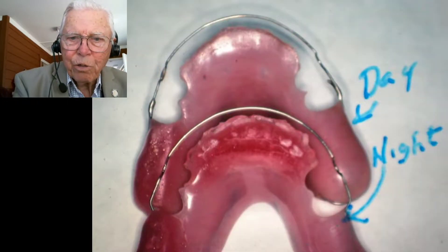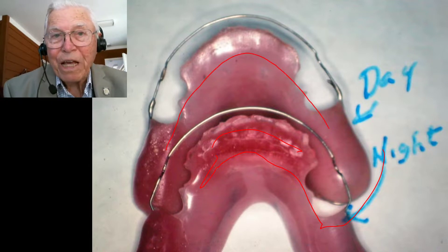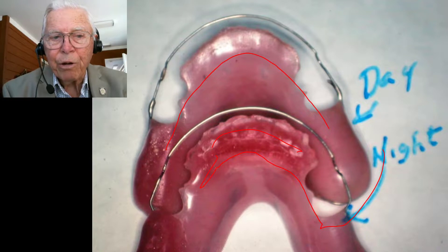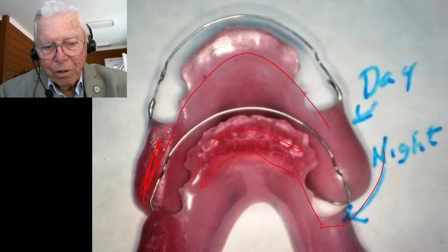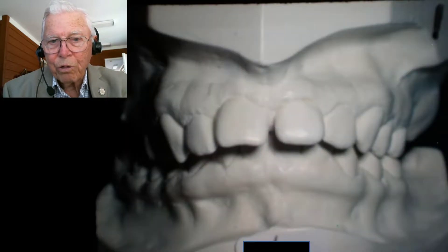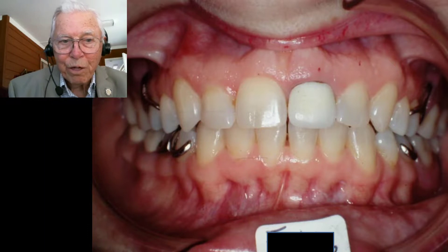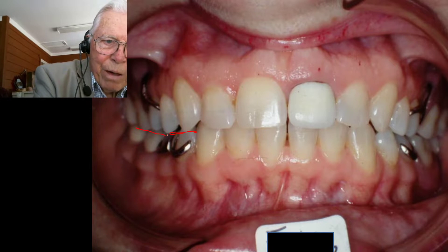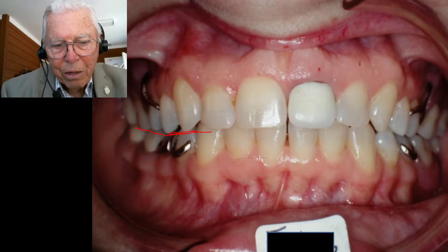Here's the night appliance — this is what she wore at night with a ramp holding the jaw out. In the daytime she would wear the day one, and she wanted to stay out there so badly and wanted to look that way that she wore it during the day too, even though we had nothing to hold it out there initially. We added acrylic to the day one and to the night appliance as well. Now here's where her jaw started, and here's where we put it. We've made partials for this. You can see these teeth are almost level with the ones in the back — we had to depress the back, and that brought things up a little bit, and now it's fitting in there well.